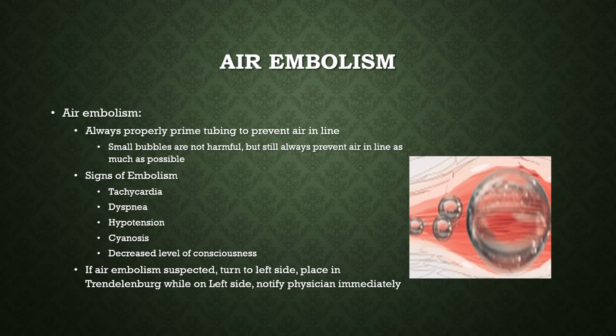We do want to always prime our tubing, and by prime the tubing, it means we run fluid through it so there's no air in the tubing. Tubing starts out just full of air, but we run fluid through it and get all the air out. However, it takes more than what's in a whole IV tubing to kill a patient of air. So you don't need to be too freaked out about it.